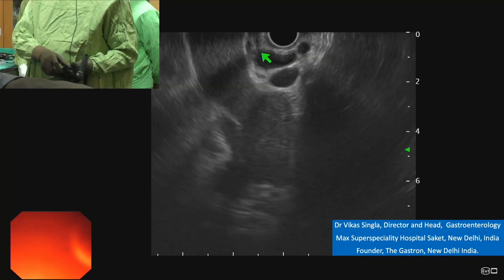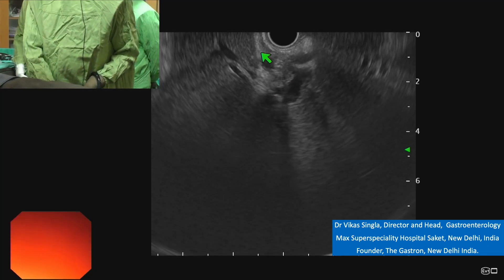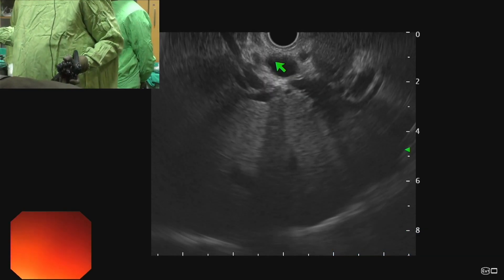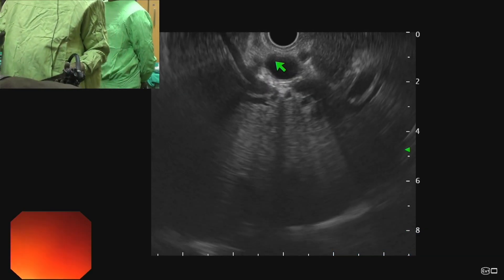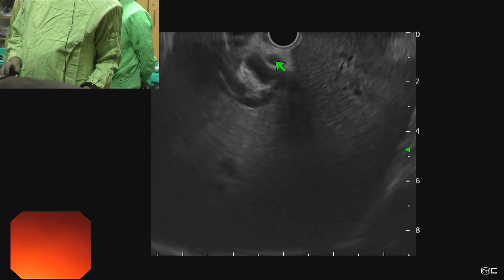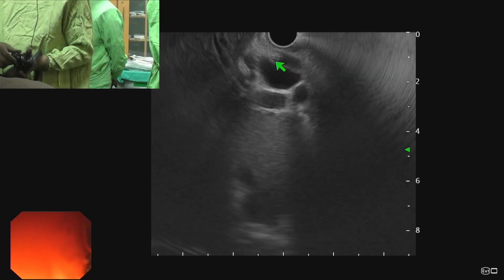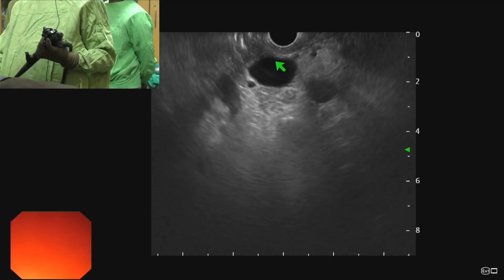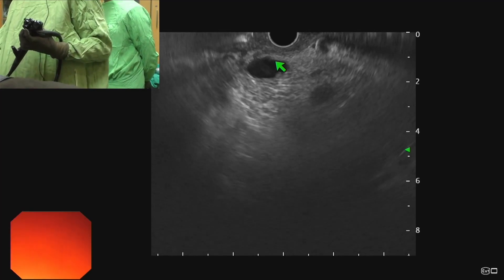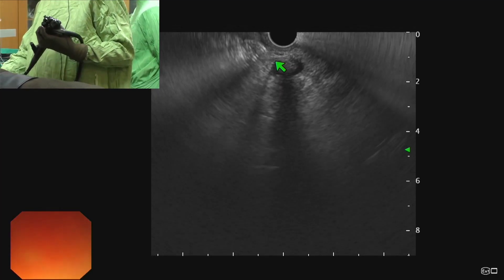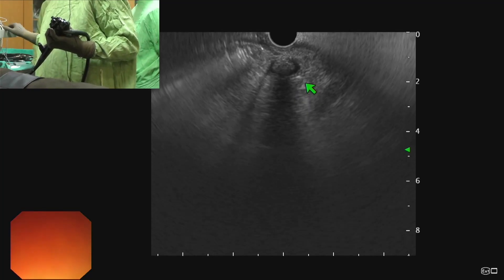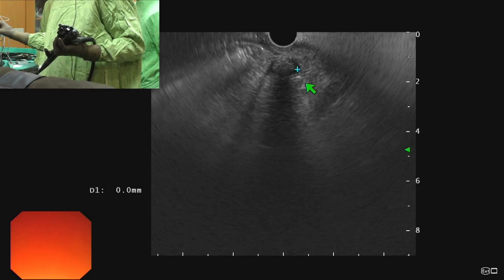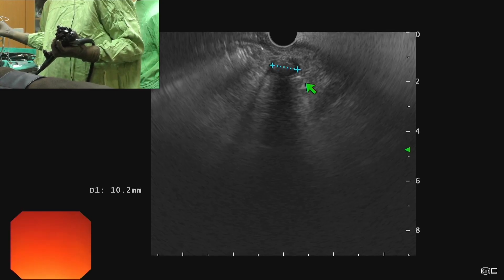When we rotate the scope anticlockwise, we can see this structure is dividing — this is the bile duct. When we drop our left hand, we can trace it into the liver, and when we rotate clockwise we can take it down. When we trace it down, it goes towards the pancreas. From the first part of duodenum we can see the majority of the CBD.